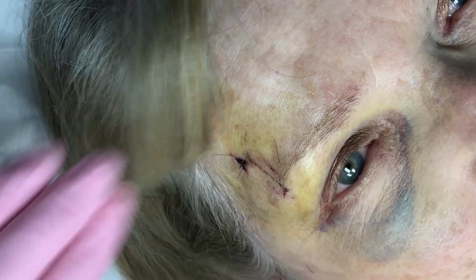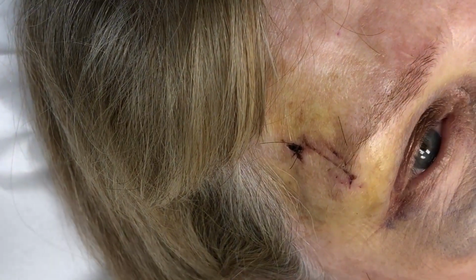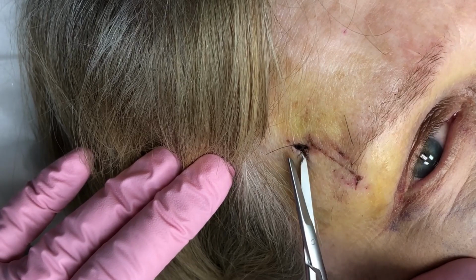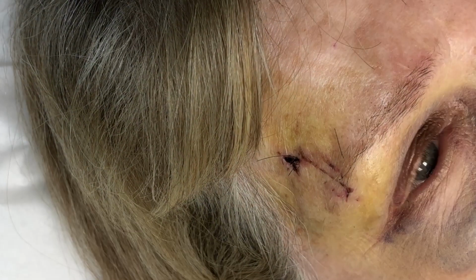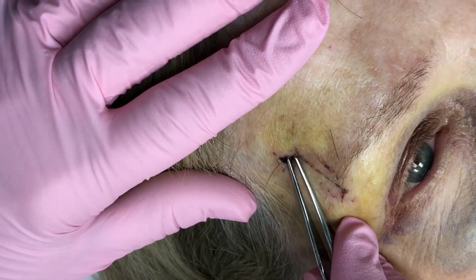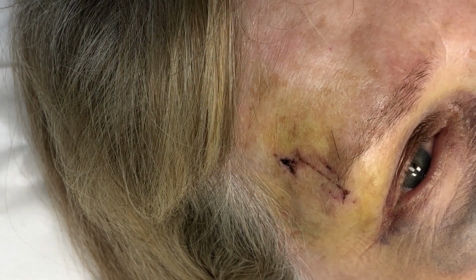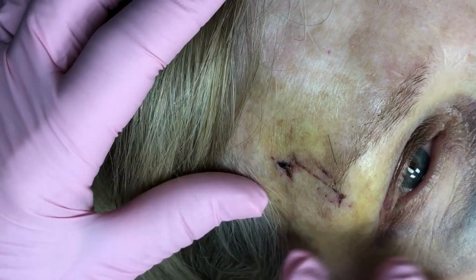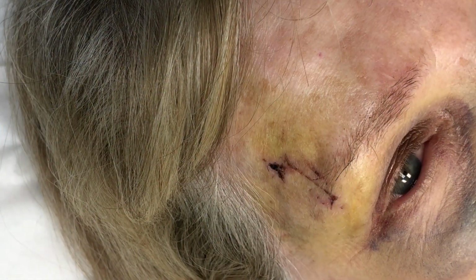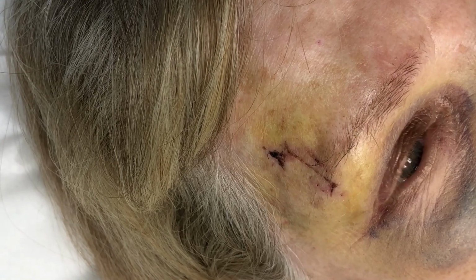It really doesn't look too terribly bad. It looks like the wound lined up very nicely. Great. You might have one that's kind of hidden down in there, huh? There were a couple of puncture wounds. My head bounced on the pavement. Oh, bless your heart. Miss Donna is just fabulous at this. I think you got them. Did they give you a count as to how many stitches they put in? 4, I think you said. I believe we got 4 out, didn't we?